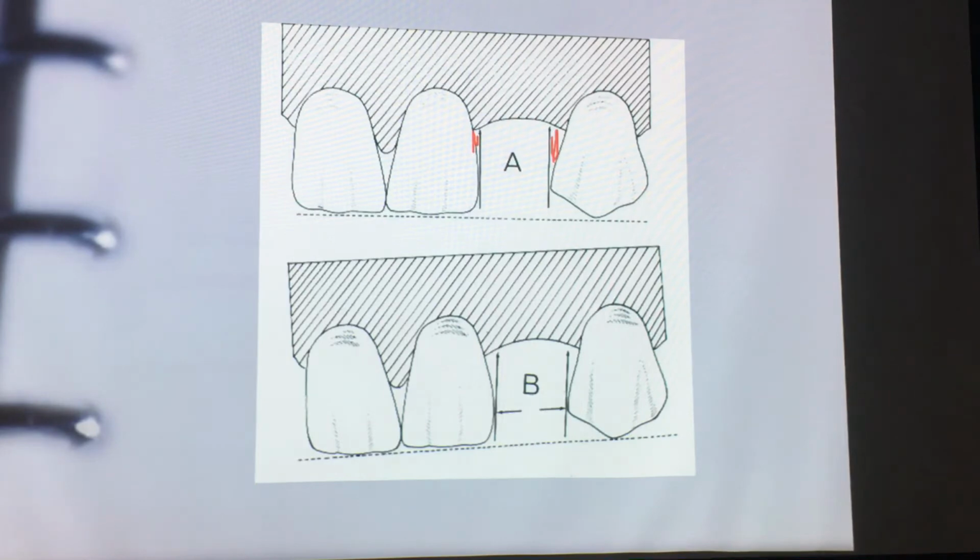If the smile line is really low, then I think we could get away with it, unless they're a big laughing guffaw. They might see those unsightly holes I'm talking about. Now, we just can't go and ask the dentist, go ahead and lop off 1/3 of the central to minimize this. I mean, that's just not going to balance the aesthetics. I think if we can create some guide planes, maybe do some creative overlapping, possibly, we can minimize that. And hopefully this tissue, once there's an extraction, doesn't start to recede up here, the tissue gets higher and higher, and there's more bone exposure of the distal side.